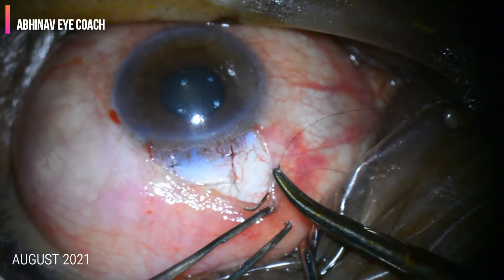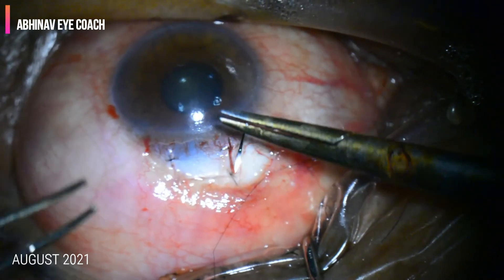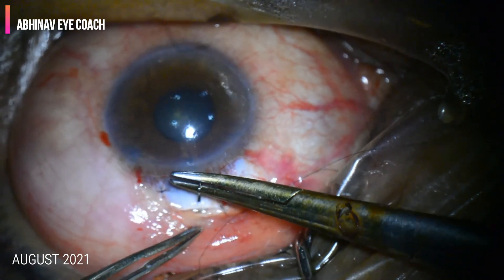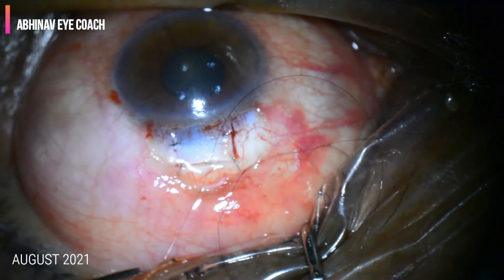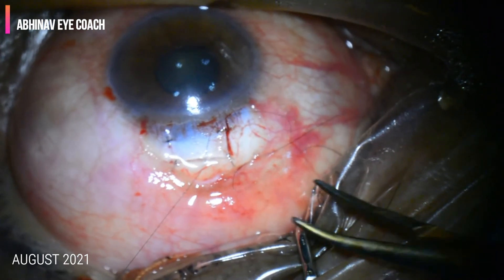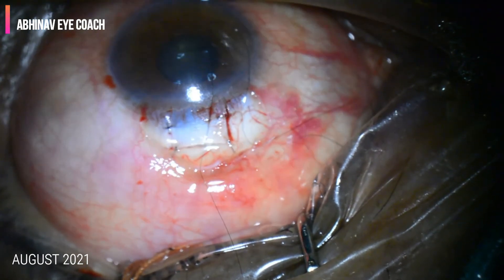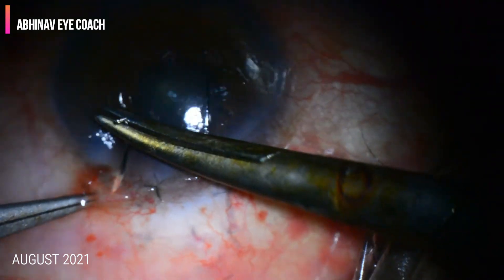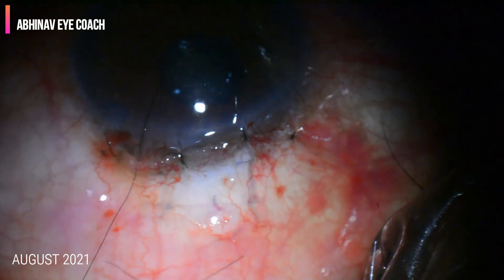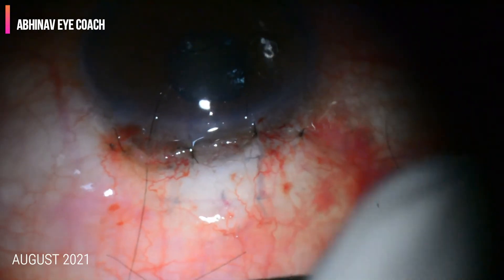We start with a 10-0 nylon suture from the outside of the conjunctiva and take it to the other side of the scleral flap, then place a 3-1-1 knot. The suture end sitting superior to the conjunctiva is left there after surgery, which can later be adjusted on the slit lamp only — to increase the flow if the pressure is high post-operatively.